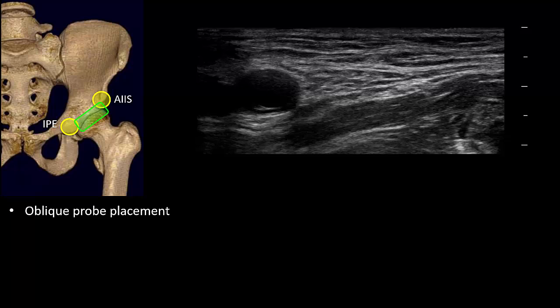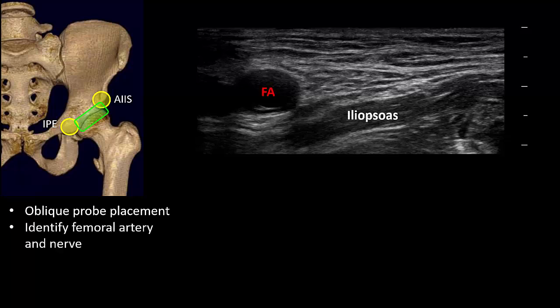The scanning phase of the technique I'm about to describe is different from what was originally described — I find it a simpler and easier approach. With the patient in the supine position, start by placing the probe in an oblique orientation over the area of the femoral artery so that it is roughly parallel to the iliopubic ramus. Identify the femoral artery, the iliopsoas muscle, and lying on iliopsoas under fascia iliaca, the femoral nerve.